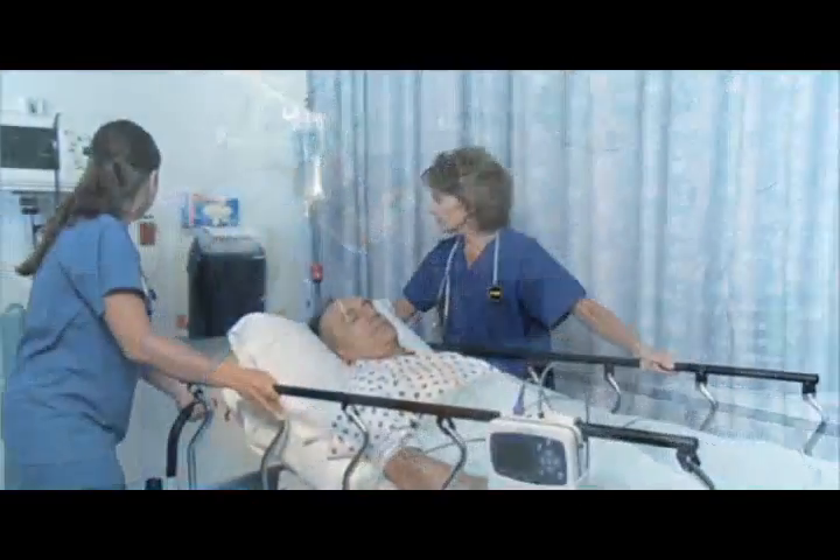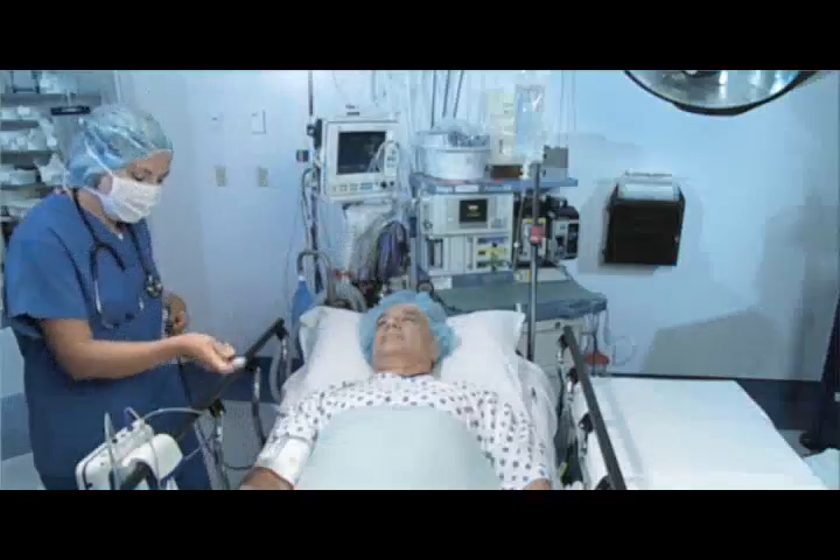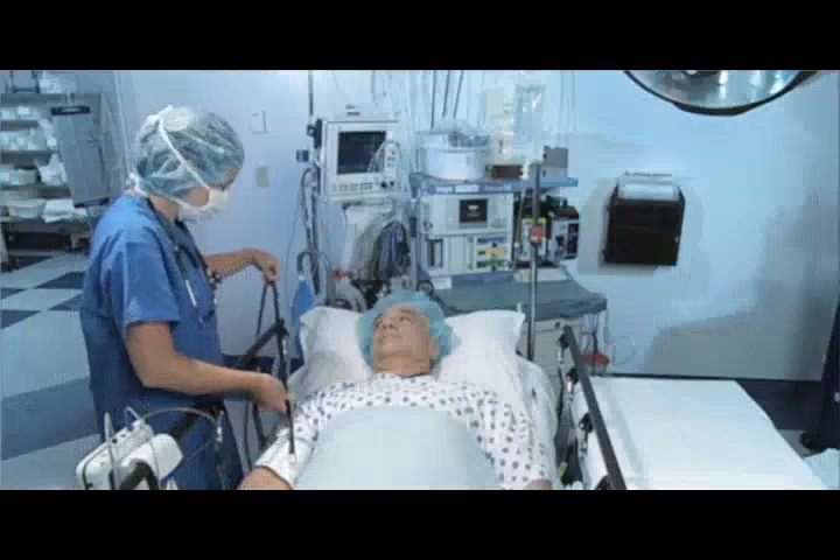Move patients from room to room, floor to floor, and department to department — all with just a single cuff to virtually any device you have in house.